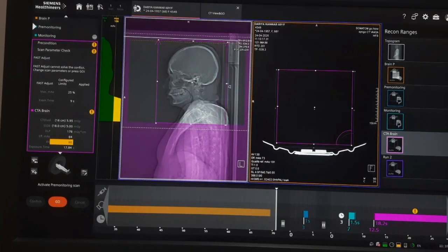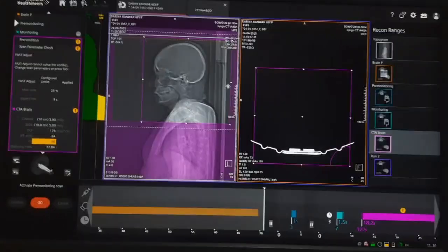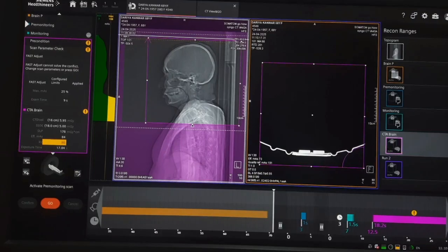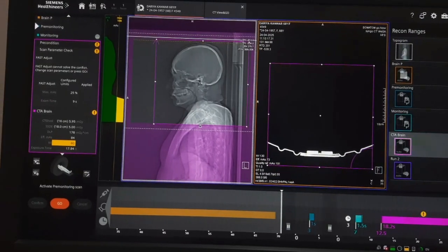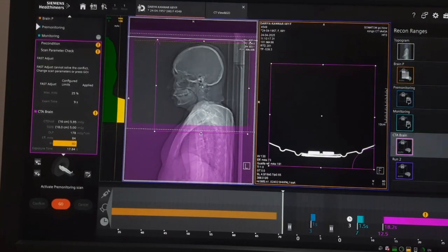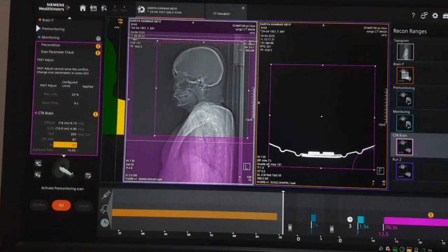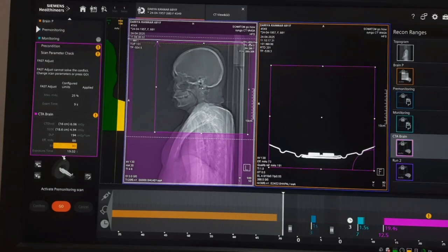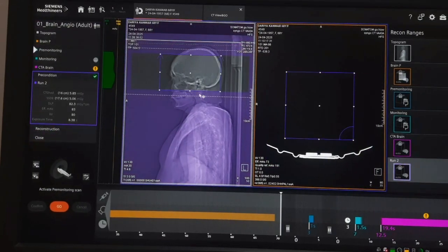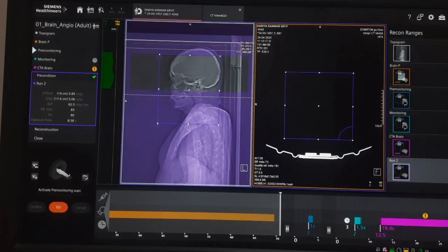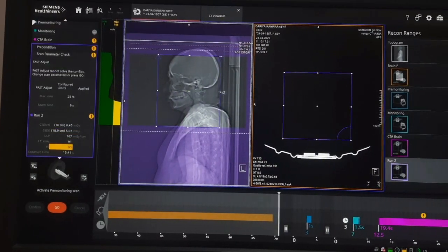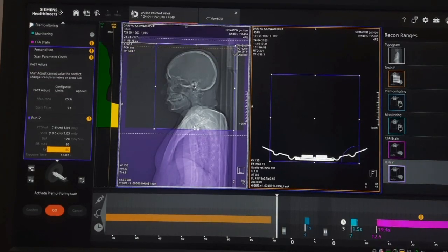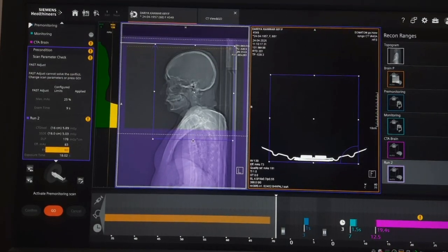Cover the area and set the topogram, then run to set the topogram for the next acquisition.